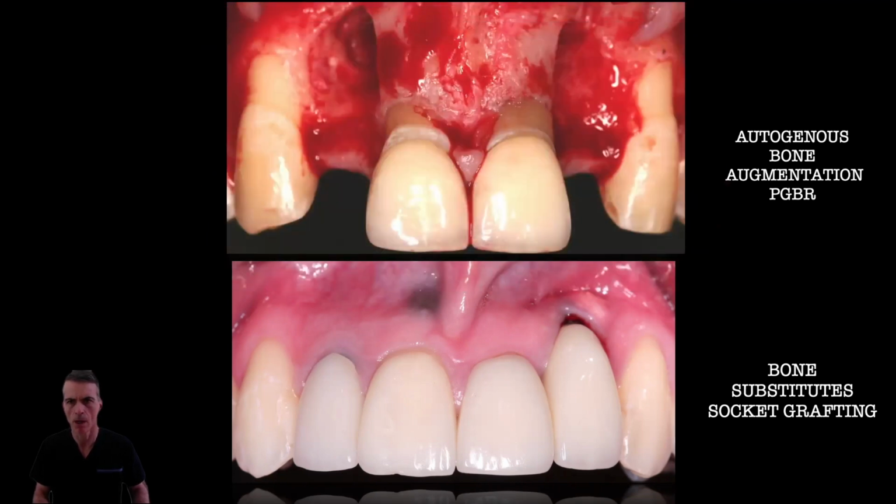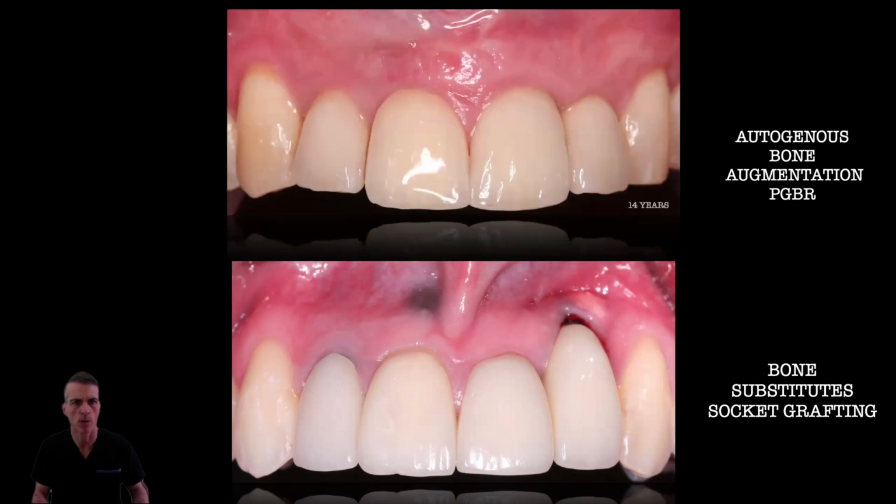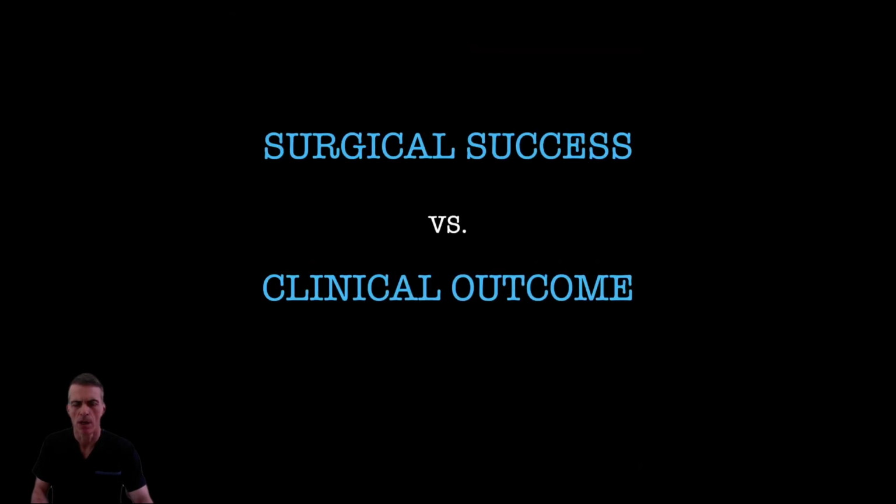The patient had some infection associated with root canals on those lateral incisors that required extraction of both lateral incisors. So after augmenting the sites with blocks, we were able to place the implants, and the case was definitely successful, maintaining healthy bone levels and really good pink aesthetics as well. So the bottom line is, I want to emphasize that it's not all about the surgery.